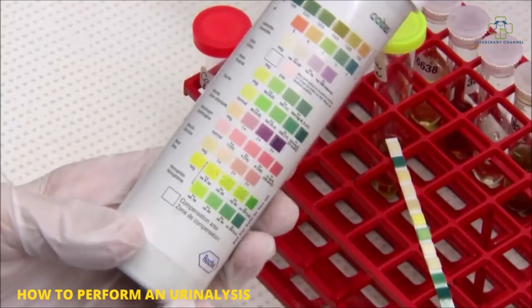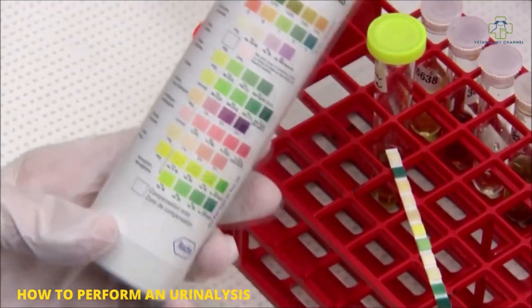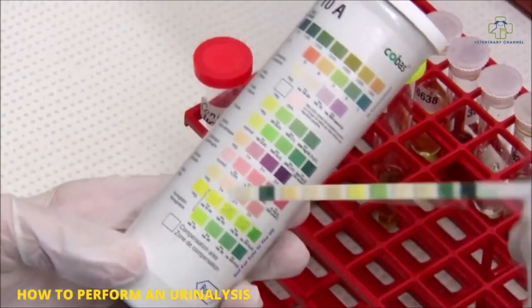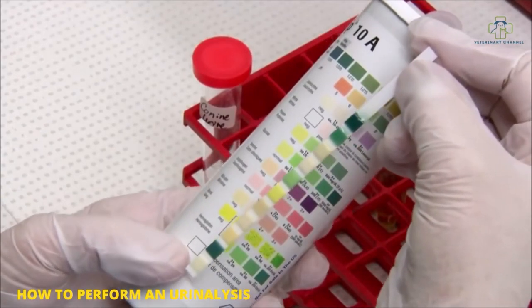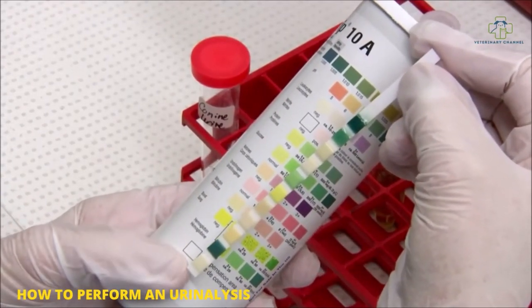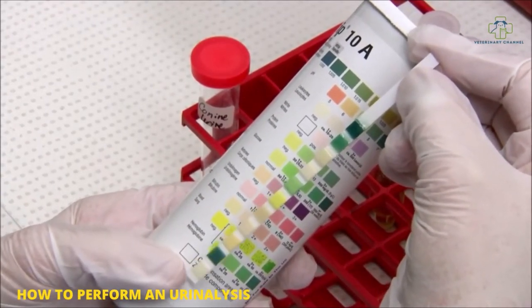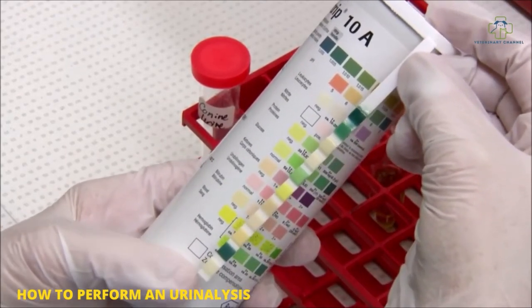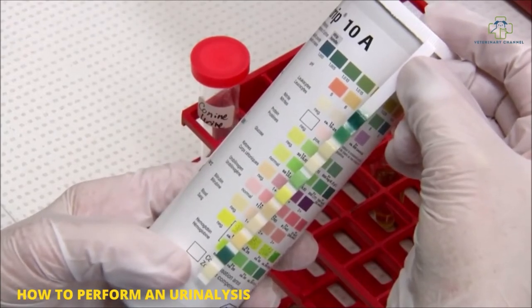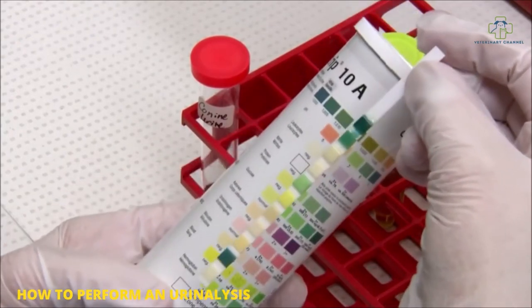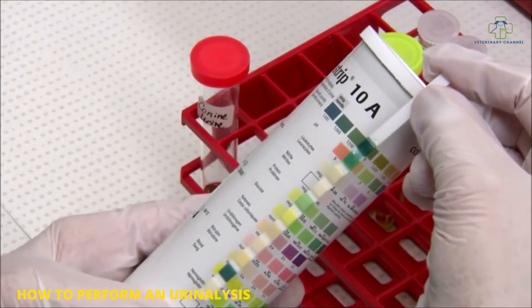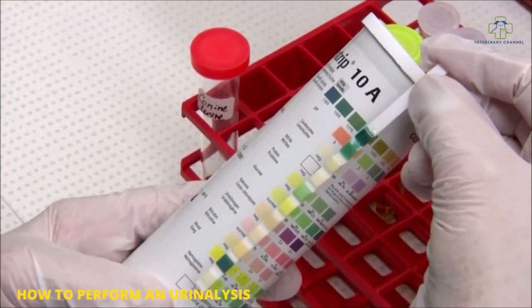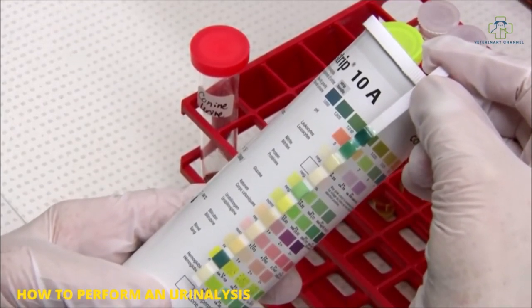We use a chemstrip 10a which is designed for an automatic strip reader. The very last square on your strip is going to correspond to the blank square at the bottom. You hold your strip with the handle at the top, and that last square corresponds to the blanking square at the bottom. To read your strip, you start with the specific gravity, which we don't read because it isn't accurate in animals.